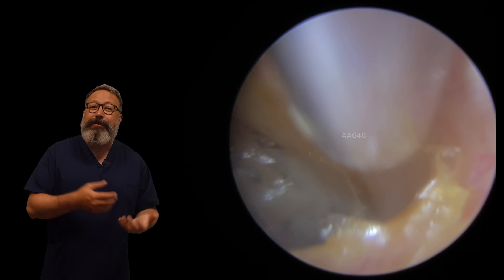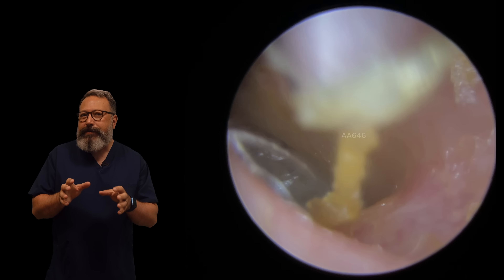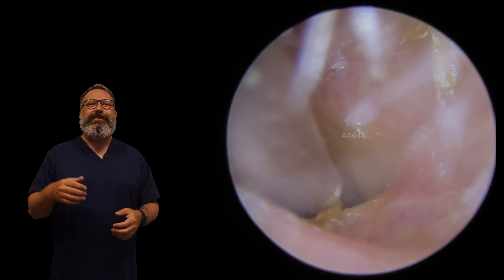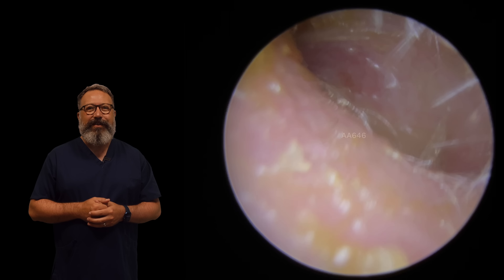I record these videos early before my clinic, which means I've only had probably about half a cup of tea, so my mouth isn't quite engaged properly yet. Bear with me on these videos. We're just getting this one out - you can see this little straggly bit of skin in there that just doesn't really want to come away.